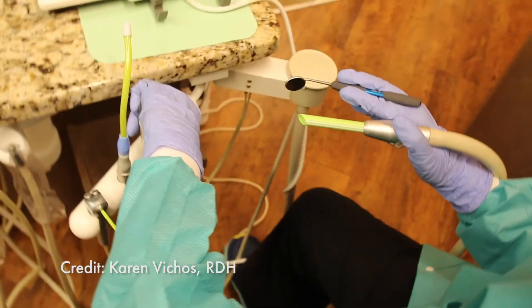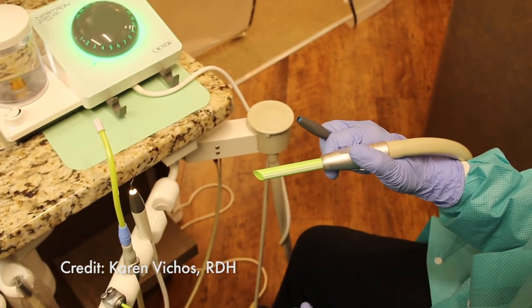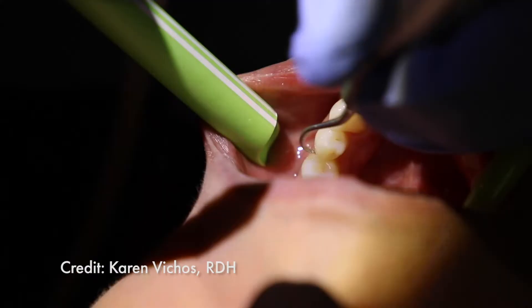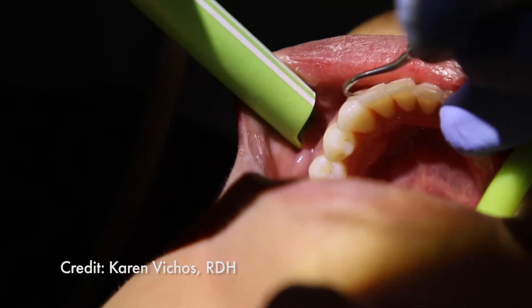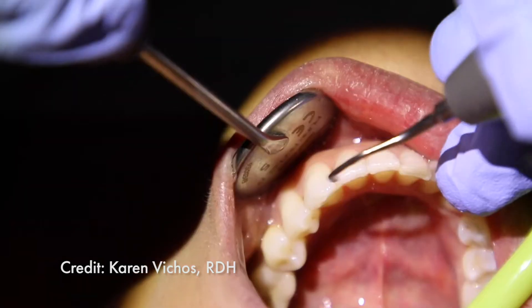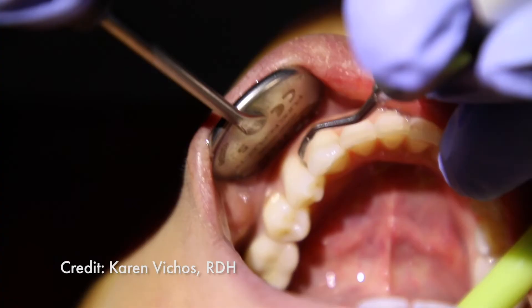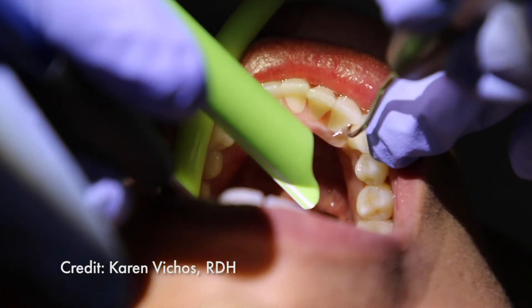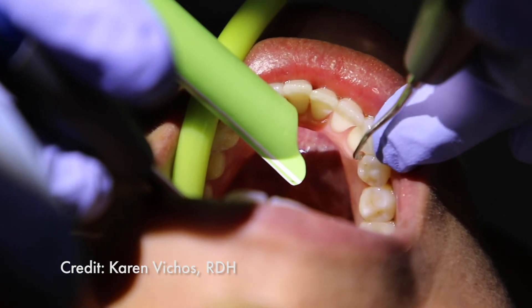This works great for lower anterior linguals. I'll also retract with the mirror if I'm doing cross-arch on linguals or buccals, or if I'm working on the same side as my non-dominant hand on the lower buccals. I can retract with my HVE, and then when I need indirect vision, I can bring my mirror back up and have indirect vision as needed.